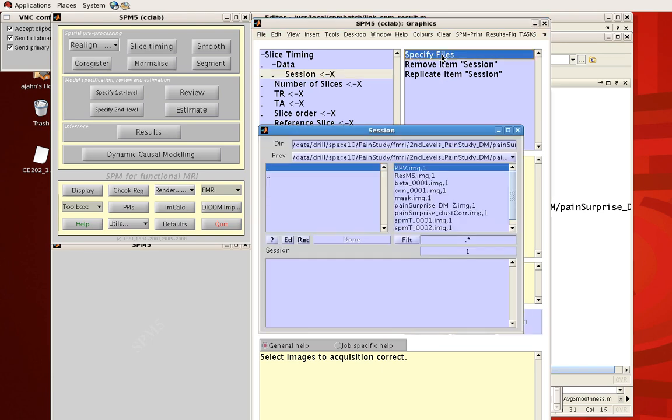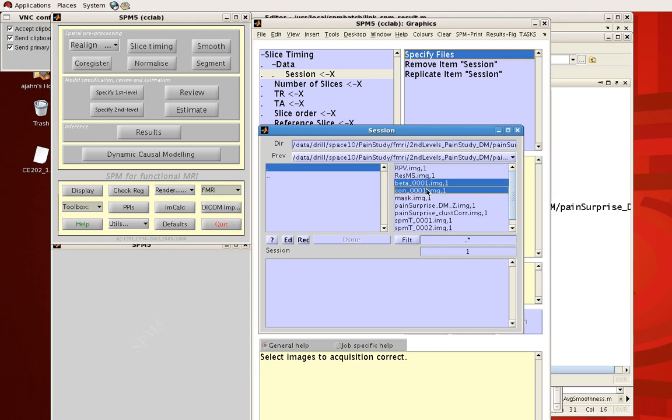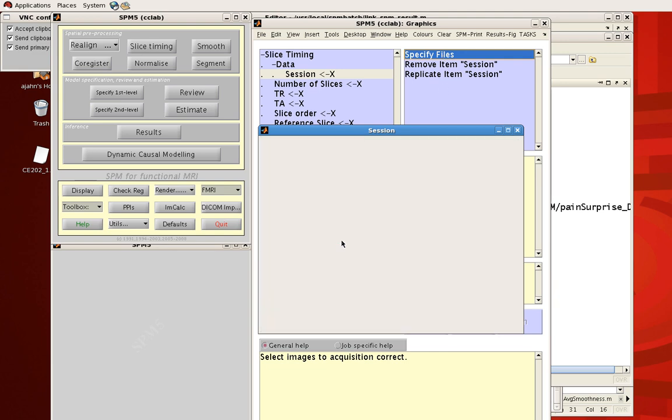Click specify files to select a couple things. Again not going into details, I've actually selected images that you would never do a slice time correction on, but the point is I've selected a couple images now it's happy. It says that yeah you filled in the bare minimum, that step is fine or at least it will run and do something.